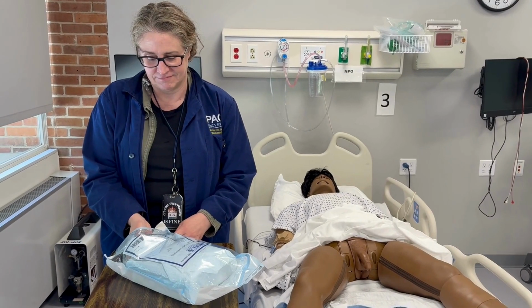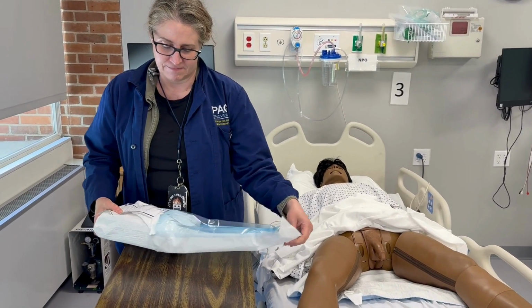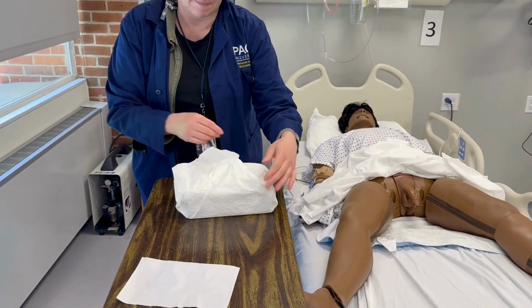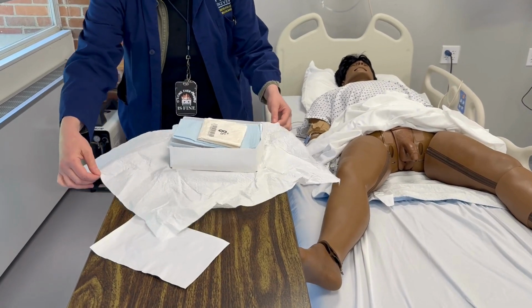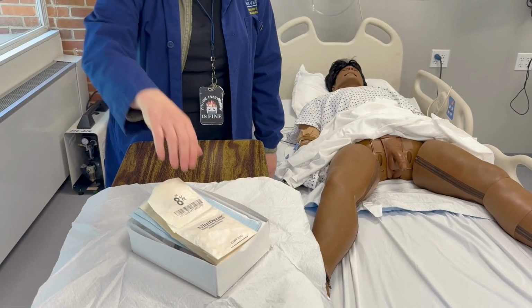Open sterile catheterization tray on a clean overbed table using aseptic technique. Don sterile gloves.